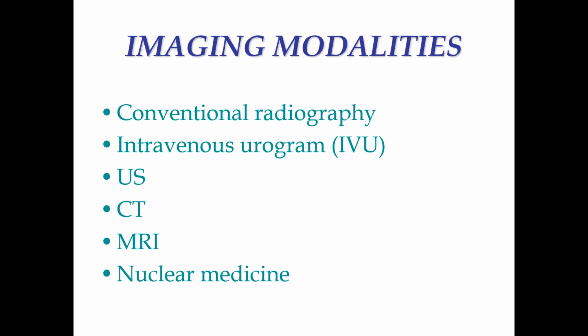Okay, so does anyone know what contrast we use in CT and MR? Iodine, okay? So the contrast that we use in CT is going to be iodine, whereas in MR it's going to be gadolinium, okay?